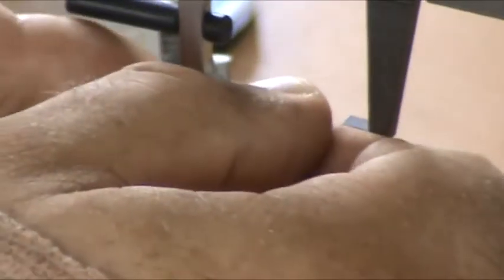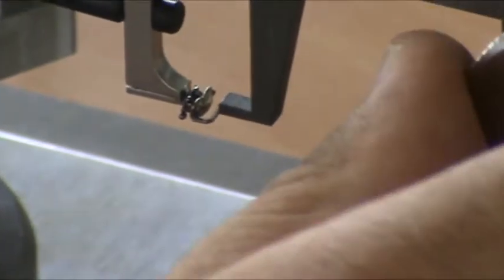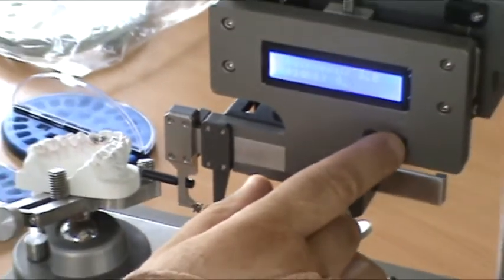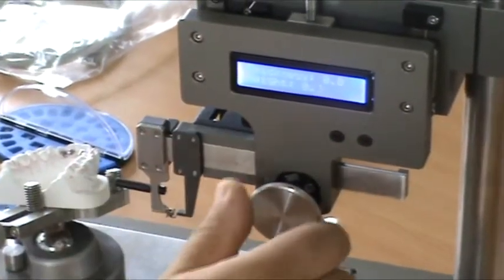This is a 22 jig for a 22 slot. Made from a molar bracket. When we put the jig on, we're going to change the thickness here. So we have to re-zero because this thickness is 5 millimeters. So I need to re-zero when I use a jig.